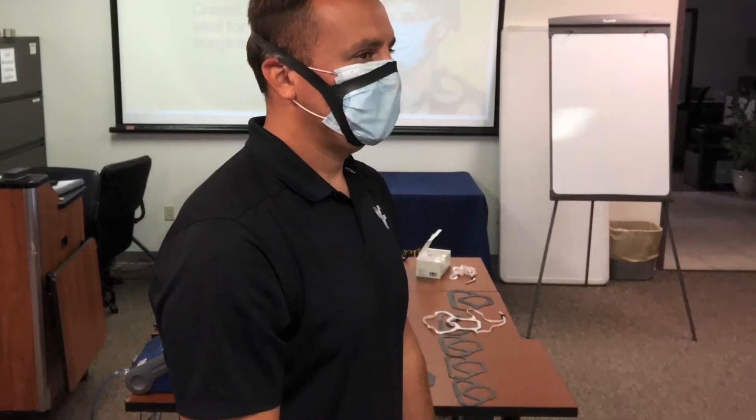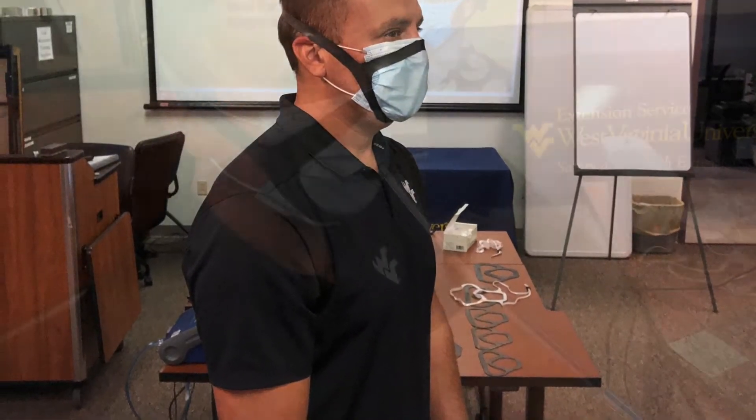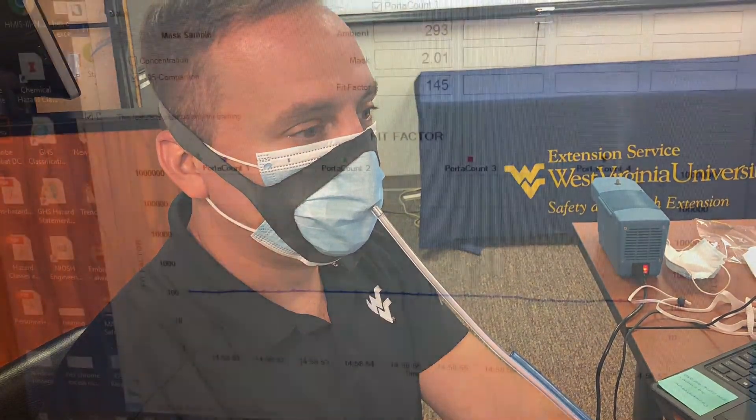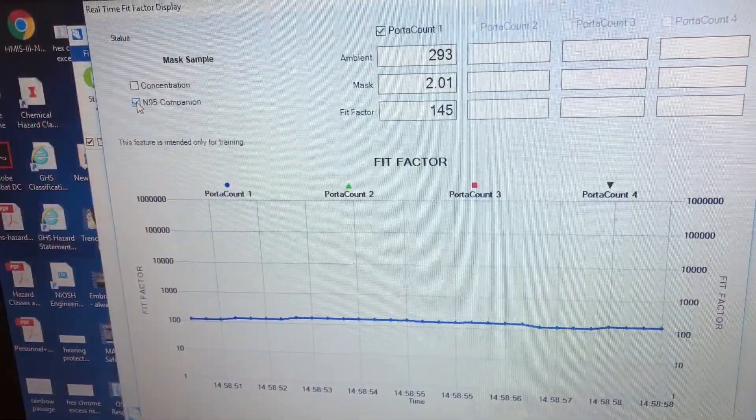Fix the Mask dot com version two is a do-it-yourself rubber face piece seal, very similar to an elastomeric respirator. The version two fit test achieved a fit factor greater than 100. Therefore, the fit test was passed.